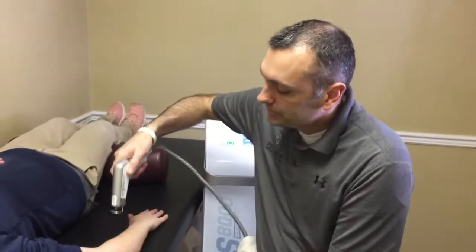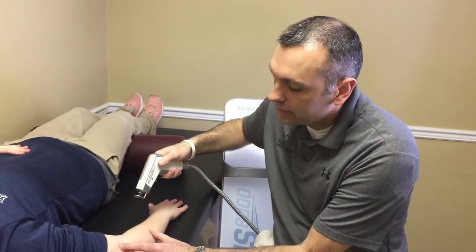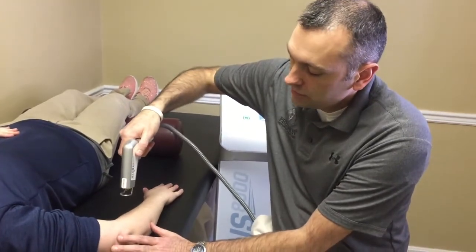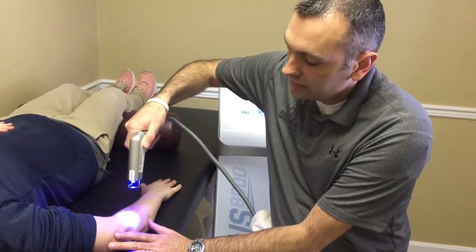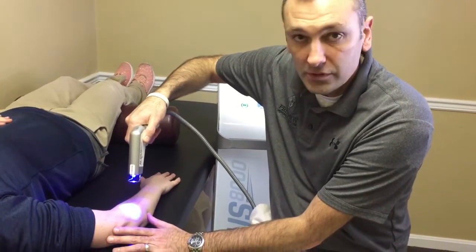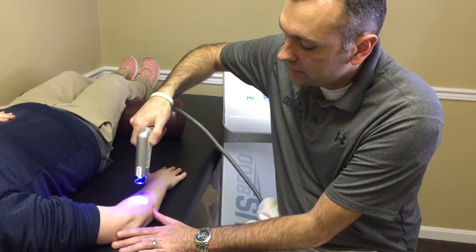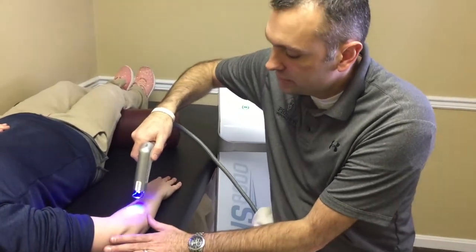Let me show you how the treatment goes. So we've isolated her to have tennis elbow, or what we call lateral epicondylitis, and we just squeeze the trigger. It'll show us a LED blue light to where the treatment is going to be administered. Then we just administer the liquid CO2 for approximately two to two and a half minutes.